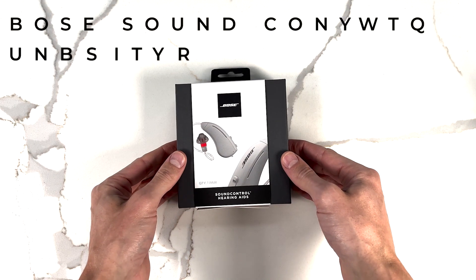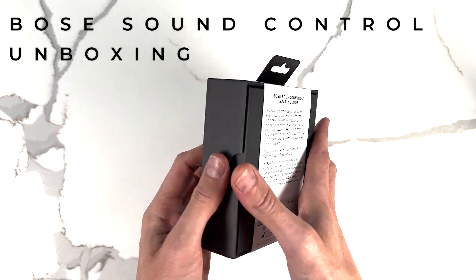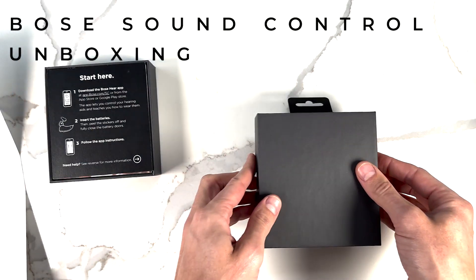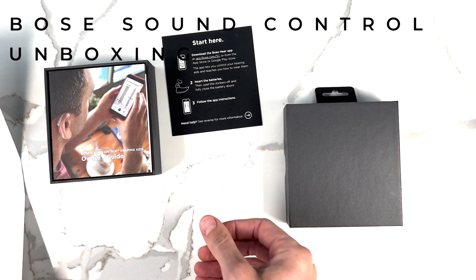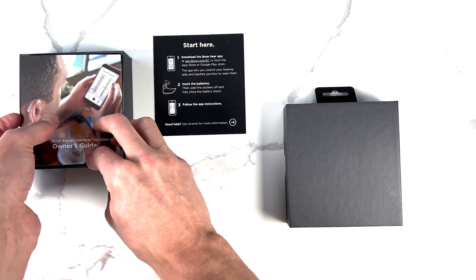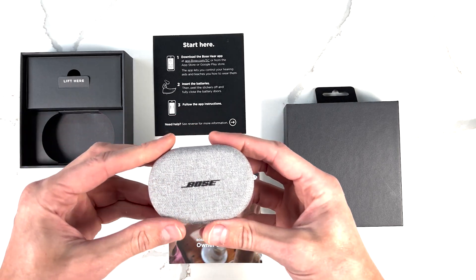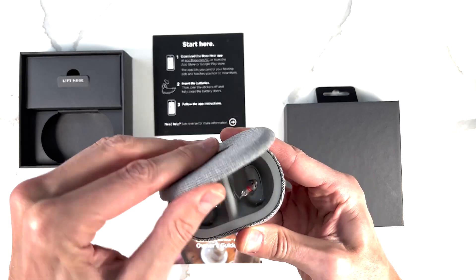I thought I'd just show you what it all looks like on the inside — I haven't looked inside this yet, so it's very exciting. This is the little case that they've come in. A little manual instructing me to download the app. So they're battery powered, these ones. And a user guide. Now this is the main event — a very nice fancy case.